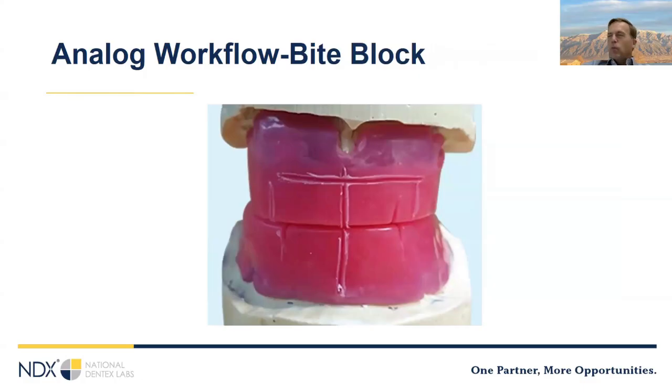So your third appointment will be your bite block. We talked about this, but the more you shape your bite block, the better your try-in appointments are going to go. So this edge here should be exactly where you want the incisal edges of the maxillary centrals. Obviously, the midline should be parallel to the facial midline. We talked about marking where you want the necks of the teeth. And then also the buccal corridor is very important. Look at the negative space in the patient's mouth and trim this so that it shows where the teeth should be.